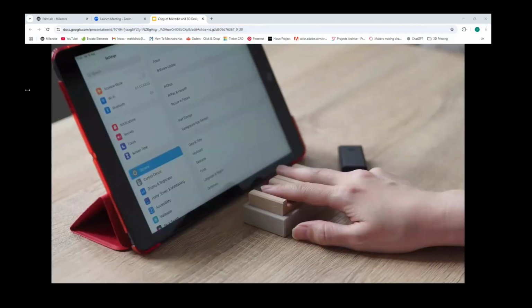So here's an image showing the tap being used with a different set of buttons. This one has some grooves in it to guide and direct your fingers. It's a really simple design, but there really is no limit to what you can do in terms of customizing the device with 3D printing.